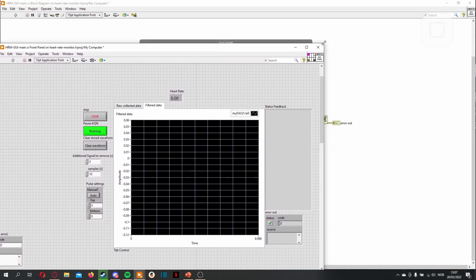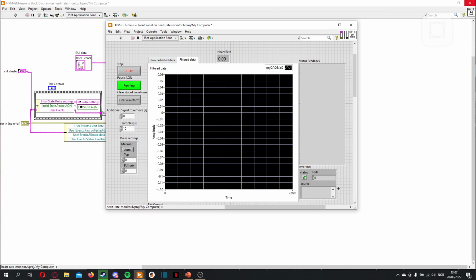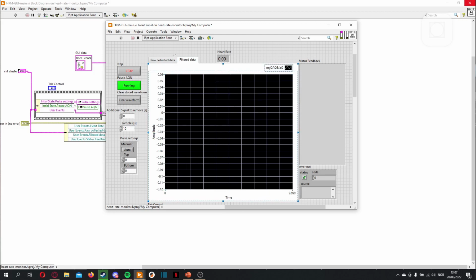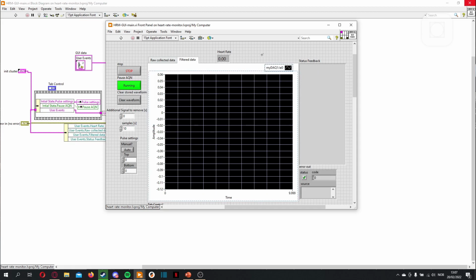So what we'll do is we'll align it. I think I'll push this one a little bit down here. We don't really need the names anymore, so we can also move these. Label, remove label, remove label, because the name is already there. Could also argue that this is not necessary too, since we basically only get one signal per. We could also push them in the same graph. So if you wanted to, we could also set visible plot legend and remove it and then get even more space. But I won't, because maybe we want to add something later.